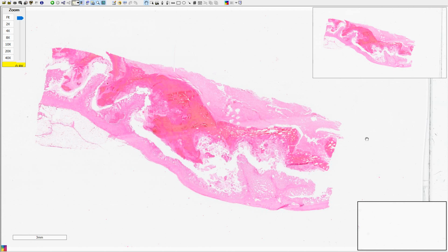Hello everyone. For today, I'm going to explain the introductions on slides for practice in histopathology, particularly slides from the gastrointestinal changes. There are in total 3 slides for the gastrointestinal organ histopathology. First slide is about coccidiosis in chicken. Next, there is also coccidiosis in cattle, and last but not least is the proventriculitis in chicken.